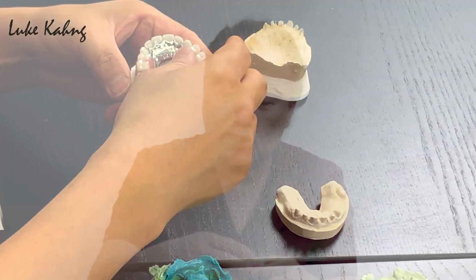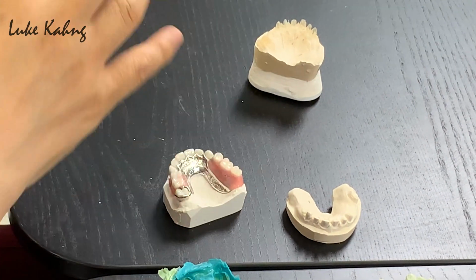Okay. And then once I have this, we have to make the frame design with the sleeve. You see my frame, just a rough metal frame, which we did on this step here, and then we put it together, and sometimes we send it out to try in, set the teeth with the dental teeth, and check the bite. Sometimes we send it out to doctors because we don't know the bite exactly. Then I have to send it to them. But if I think the bite is a good centric bite, then we finish processing. So this one is the finished process, as you can see. That's what I would like to share.